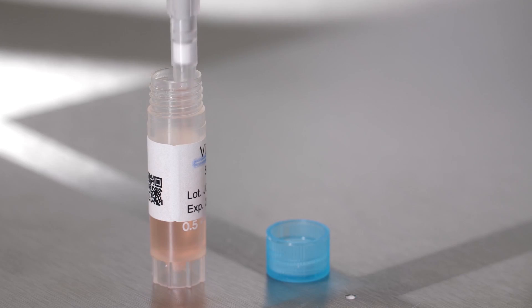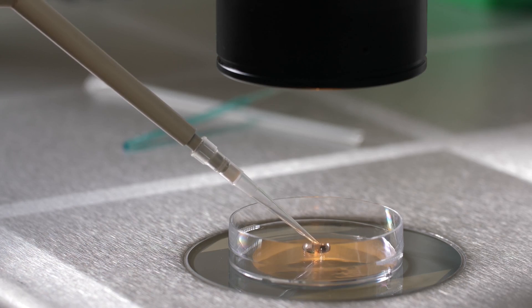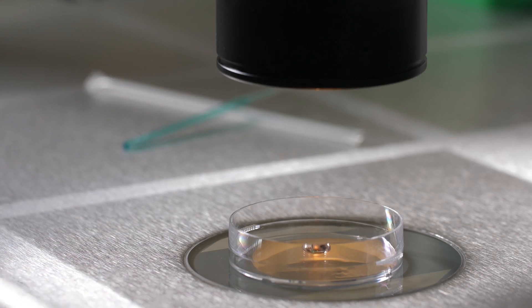Frozen embryo transfer utilizes an incredible technique of vitrification or cryopreservation to preserve embryos created during an in vitro fertilization treatment cycle.